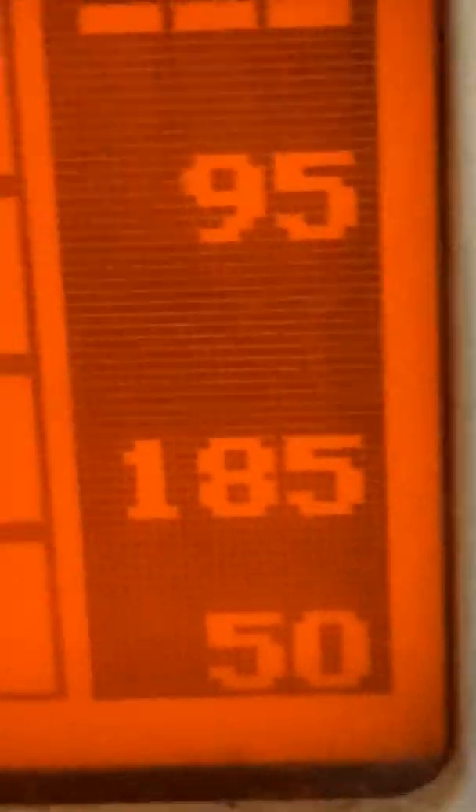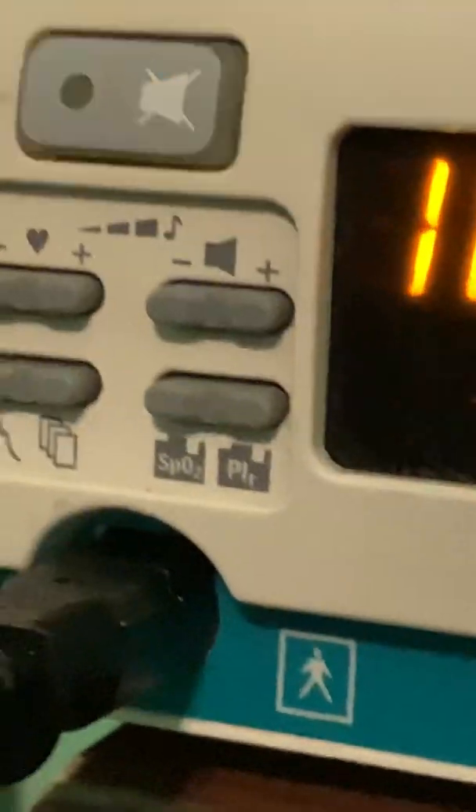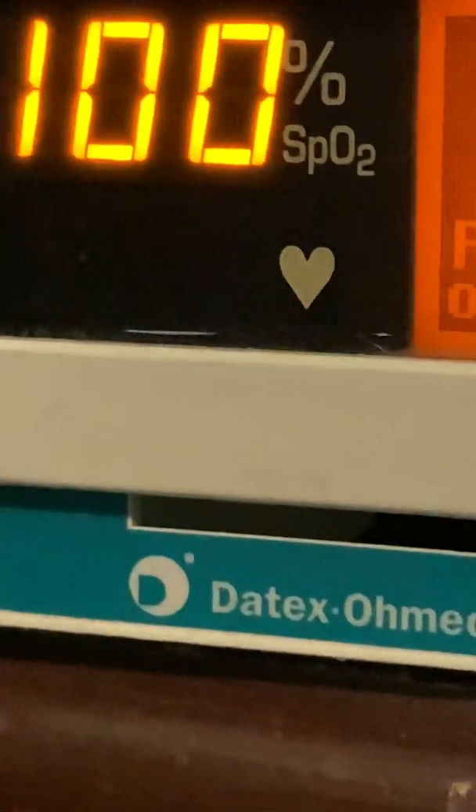This is the low oxygen saturation alarm. This is the high and low heart rate alarm. If I set the low heart rate alarm to 140, notice that it's a medium priority alarm — it's flashing in yellow instead of red. Whereas it would be flashing in red if it were a high priority alarm, and it gives you three beeps every few seconds.